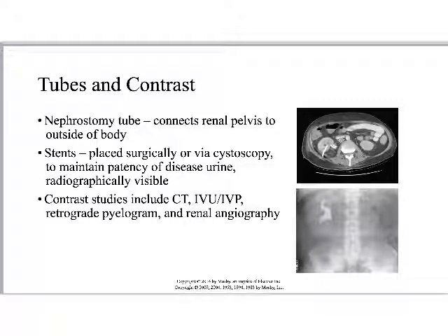With CT, we can look at the kidneys without contrast or with contrast. Without contrast is super helpful if we're just trying to see kidney stones, any kind of calculi. We do not need contrast. We do need to question why we're not going to ultrasound first, but we do not need contrast. In fact, the contrast would get in the way of what we're trying to see.